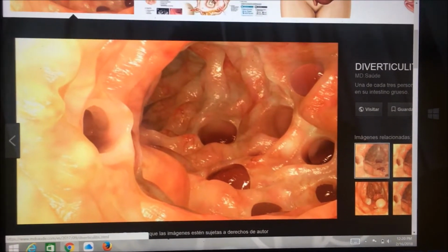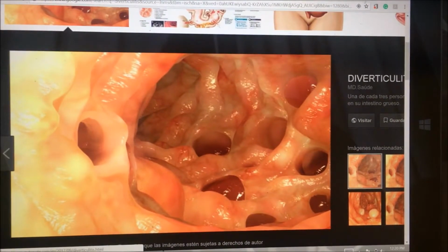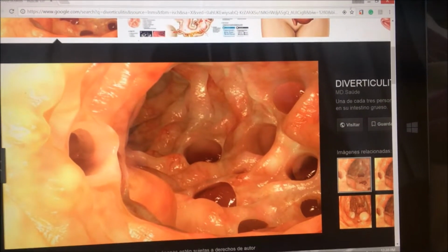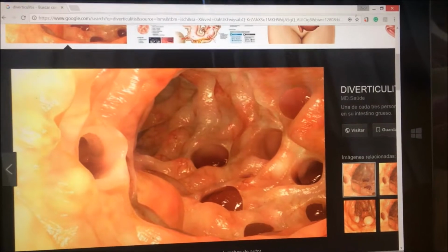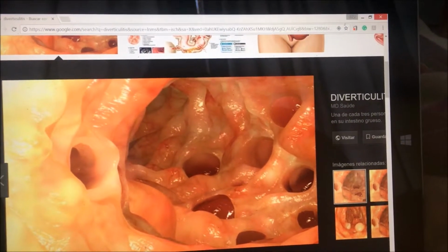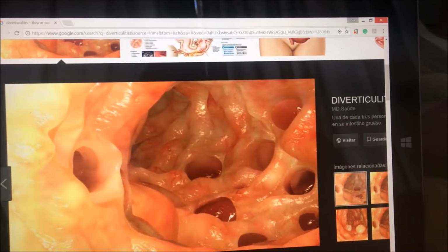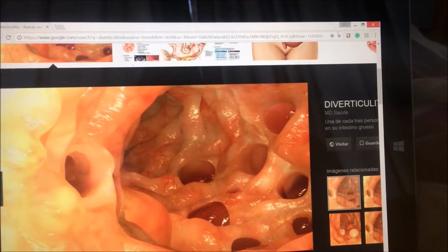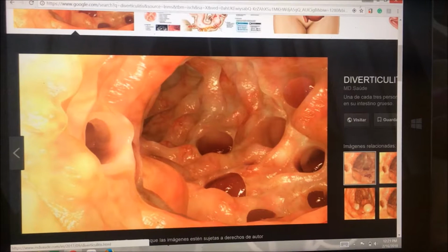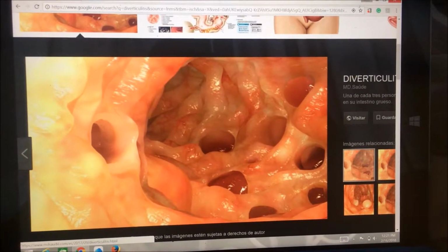Diverticulosis is outpouching caused by herniation of the mucosa and the submucosa through the muscular layer at points of weakness in the bowel wall. Incidence increases with age. It occurs most commonly in the sigmoid portion of the colon. The procedure that we use for this pathology is a double contrast BE, so we can see where the outpouchings are.